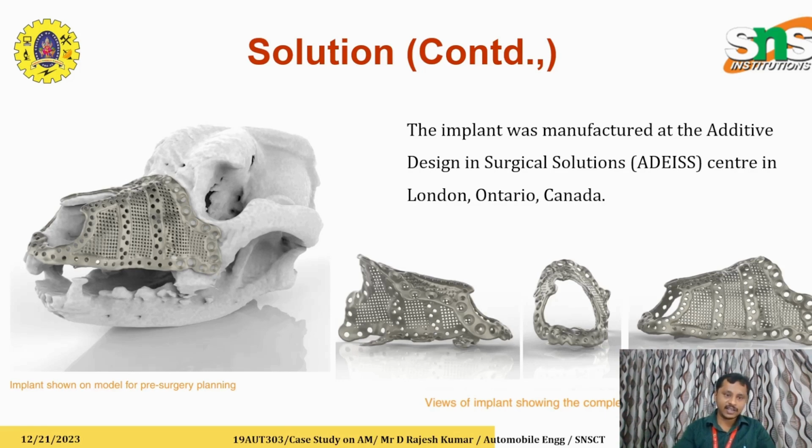You can see in the image, on the left hand side, the nose area is replaced with the implant. On the right hand side, you can see the various views of the implant. This is the complex geometry. This was done at the Additive Design in Surgical Solutions Center in London, Ontario, Canada.